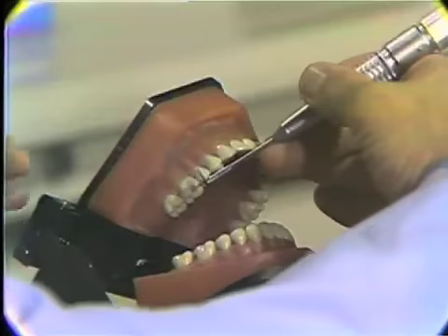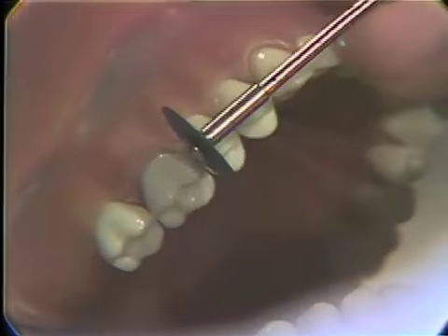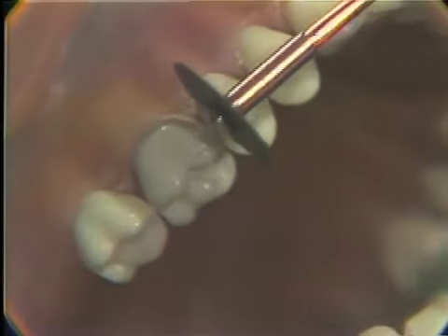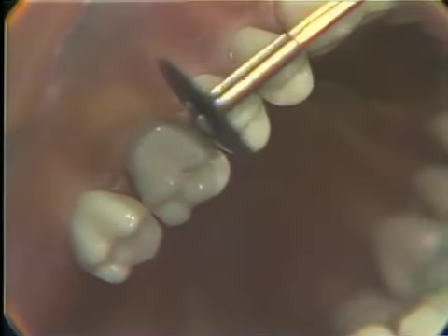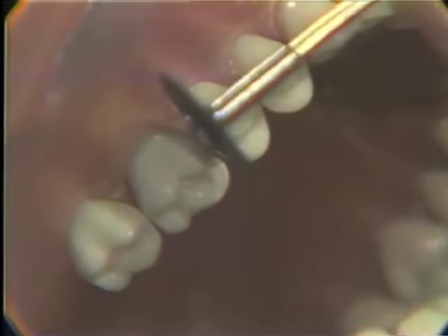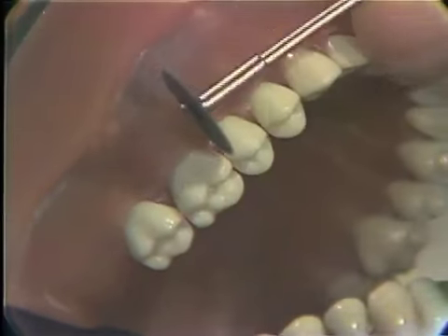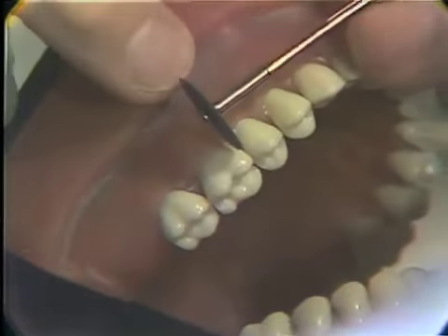Now we will go into here and show the convenience form, or the freedom of the disc that we need for placing this slice. As you can see, as I'm trying to go into the buccal with my disc, it catches. Notice the catch. This is wrong. If we start now, all that we will do is catch the disc, and it will have a tendency to run into the gum tissue or into the finger that you would have here as a protector.